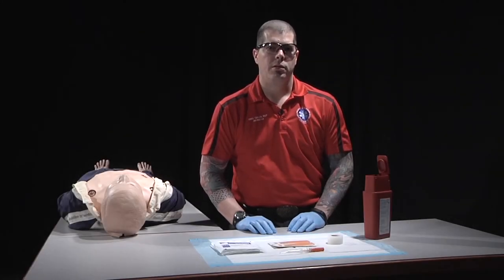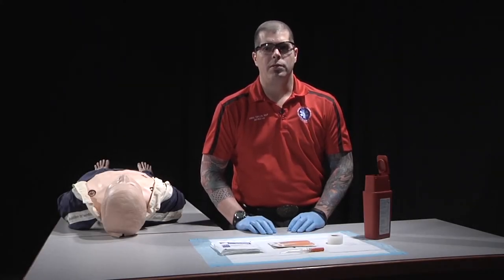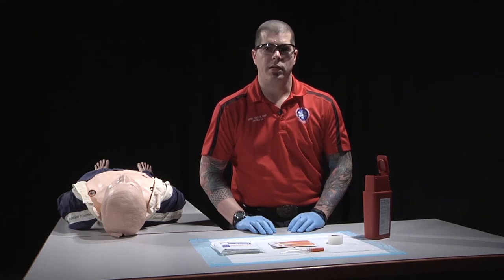Today's skill is pleural decompression. After managing the patient's airway as necessary and identifying the signs of a tension pneumothorax, we'll assemble the necessary equipment.